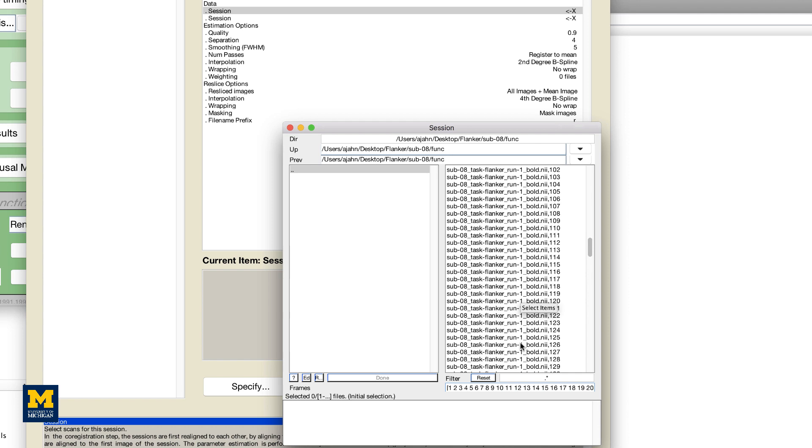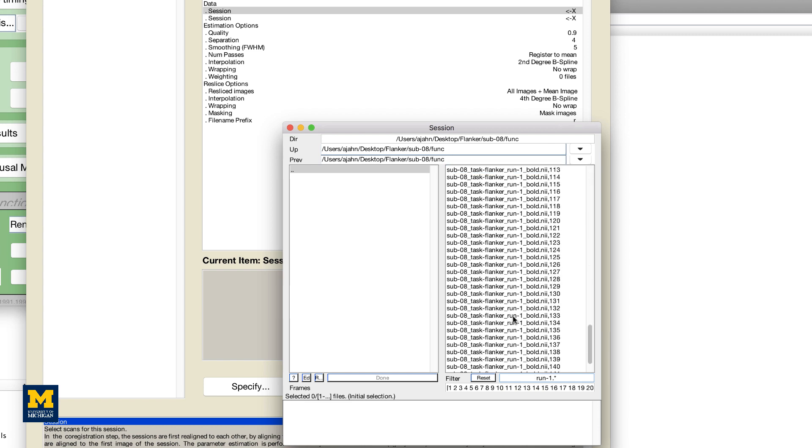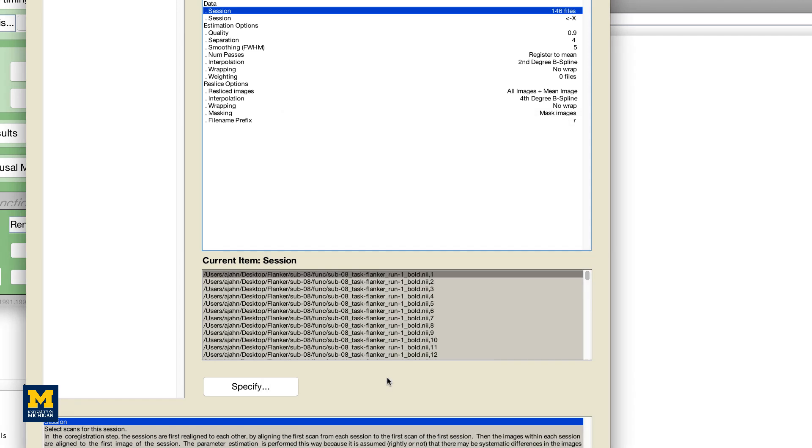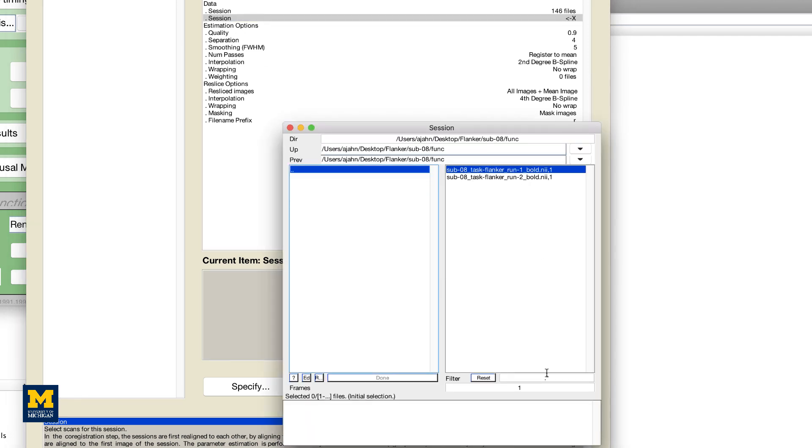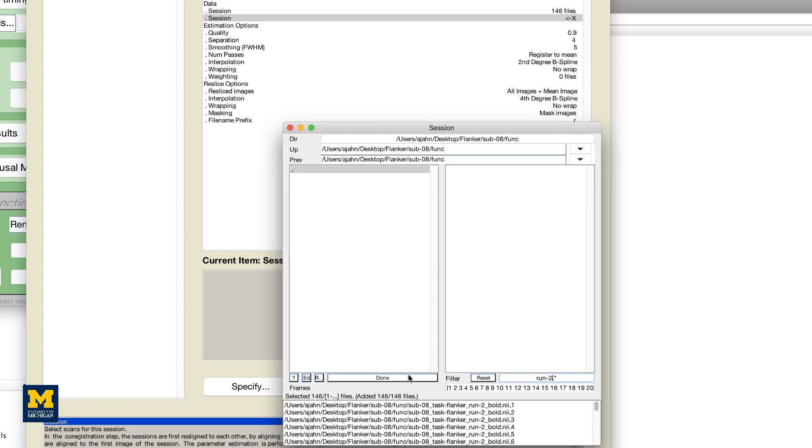To restrict our file selection to Run1, we can instead use the Filter field. This field uses regular expressions, a type of coding shorthand to indicate which characters to include in a string. In this case, to the left of the dot asterisk characters that are already in the field, type run-1 and press Return. This will display only those frames which include the string run-1. Then either click and drag to select all of those images, or right-click in the selection window and click Select All. When you are finished, click Done. Now do the same procedure for the second session using the Filter field to restrict your search to frames containing the string Run-2.